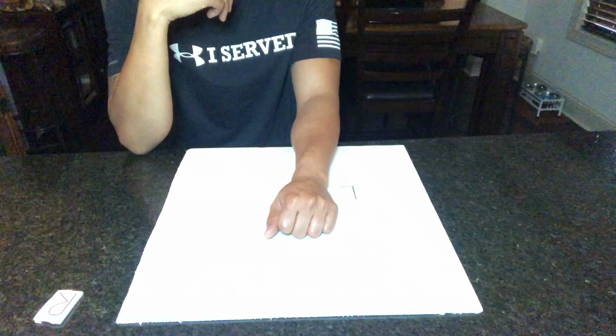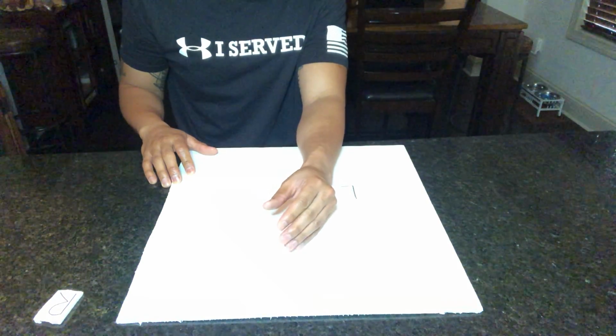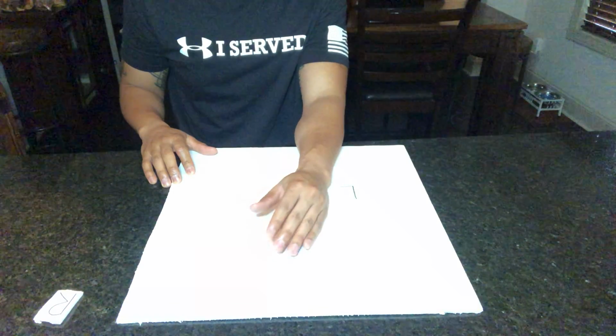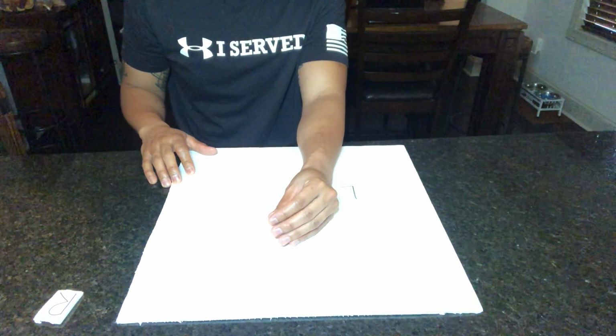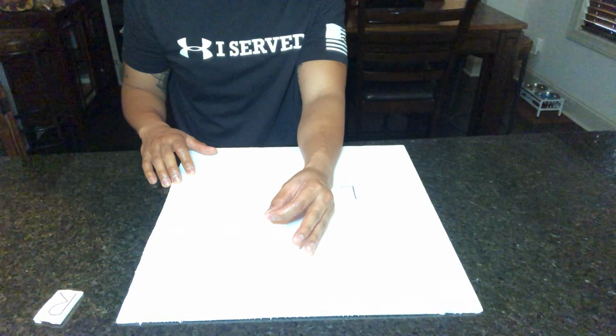So the PA oblique wrist, I'm going to have the patient roll the hand up, kind of make sort of like the OK symbol here.